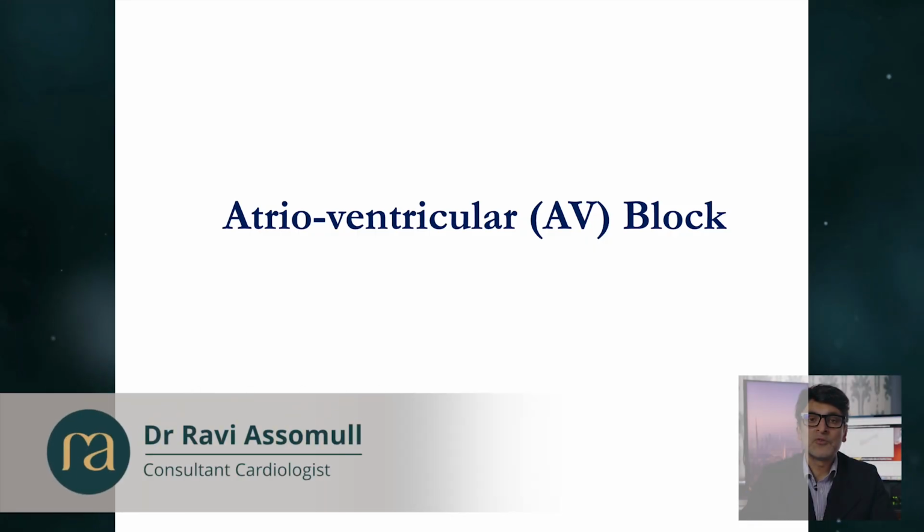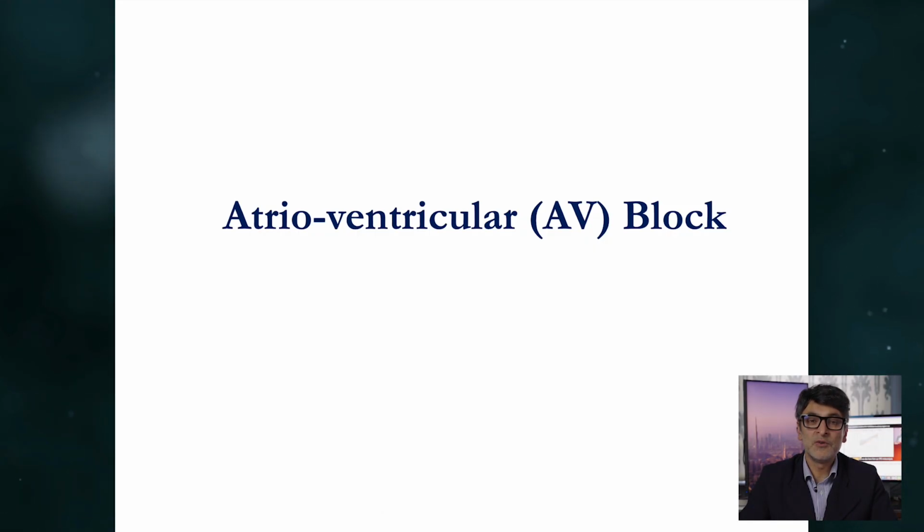So I'd now like to talk to you about AV node disease, atrioventricular block, which is really where a lot of the red flag opportunities, for want of a better term, arise. And certainly this is something that in primary care you really need to ensure that you never miss. And the good news is, by asking yourself two simple questions, you will never miss high degree AV block.